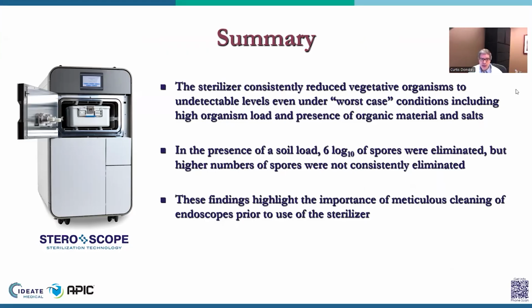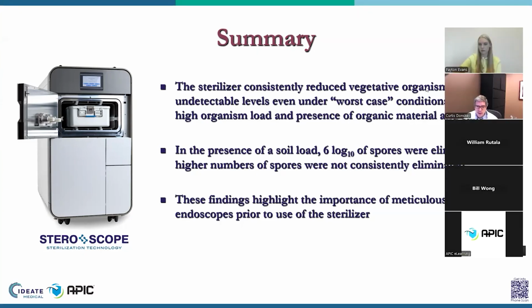In summary, the sterilizer consistently reduced vegetative organisms to undetectable levels, even under worst-case conditions, including a very high organism load and the presence of organic material and salts. In the presence of a soil load, 6 logs of spores were eliminated, but if we had higher numbers of organisms as a challenge, they were reduced, but not consistently completely eliminated. So these findings, I think, demonstrate the effectiveness of the sterilization technology. It's very effective in reducing organisms, but they also highlight the importance of meticulous cleaning of endoscopes prior to use of the sterilizer to ensure patient safety.